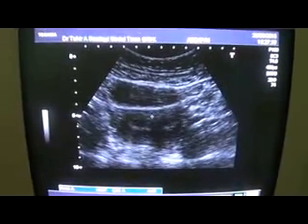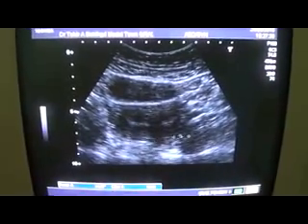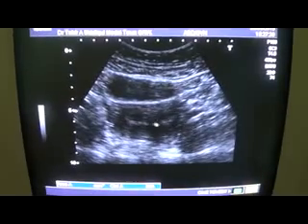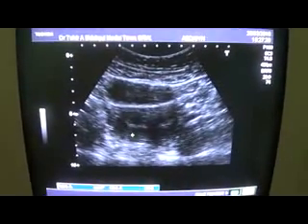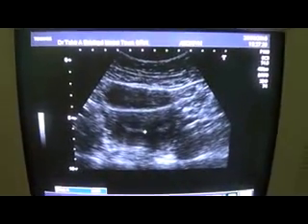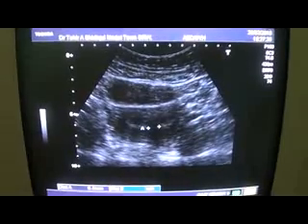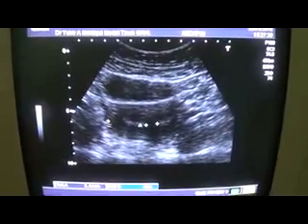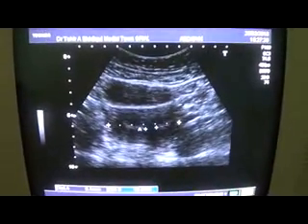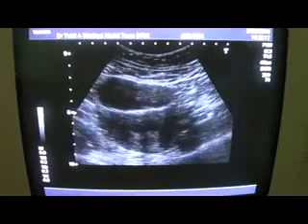You see that this is the myometrium, transverse section of the uterus, and the echogenicity of the area in between these two endometrial canals is the same as that of the other myometrium. The distance between the two canals is approximately 9.4 mm, and in transverse section the size of the uterus is 6 centimeter, and normal should not exceed more than 5. So this is our first study.